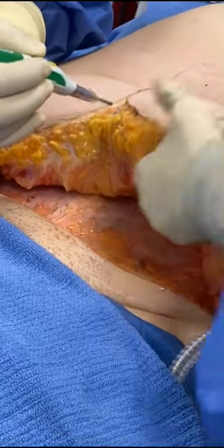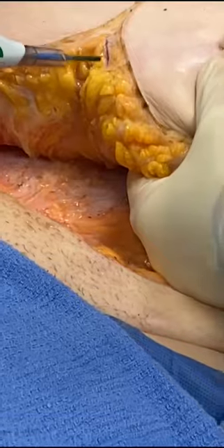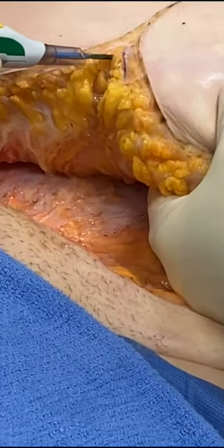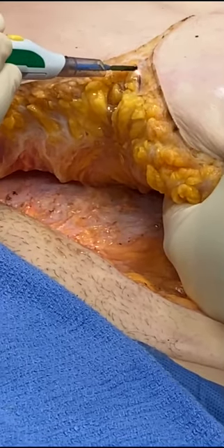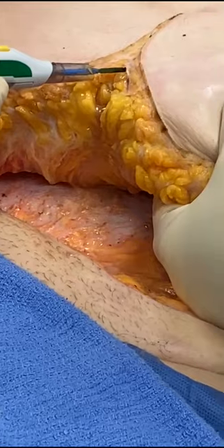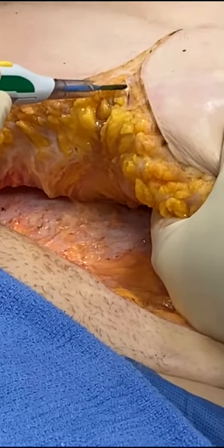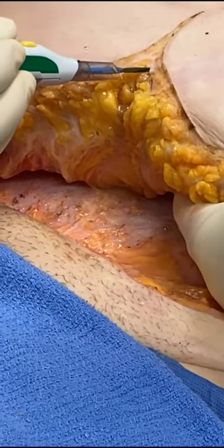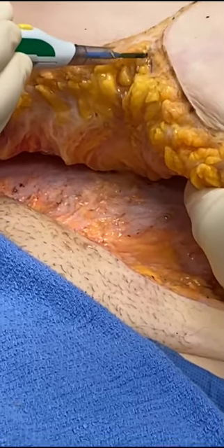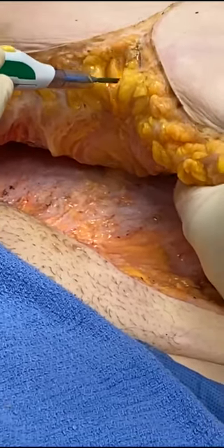But I'm going to show you this blood vessel right there, Nicholas. You see that blood vessel, Nicholas? Yeah, that's something that you may want to electrocoagulate. But you see how it turns white? You see that? Yeah. It's incredible, huh? And that's just doing a demonstration for you guys. But that's how you see these blood vessels, and then you go through it.